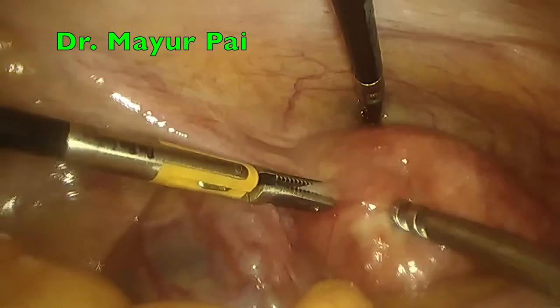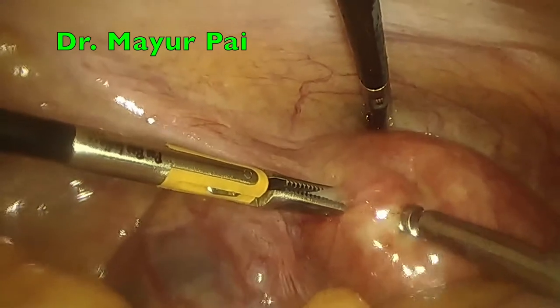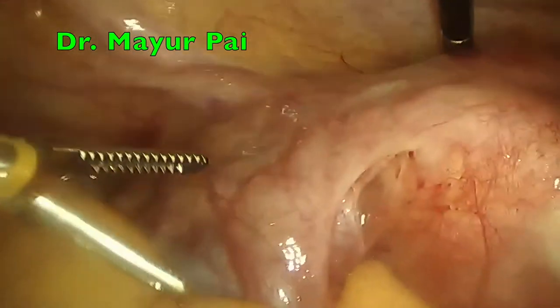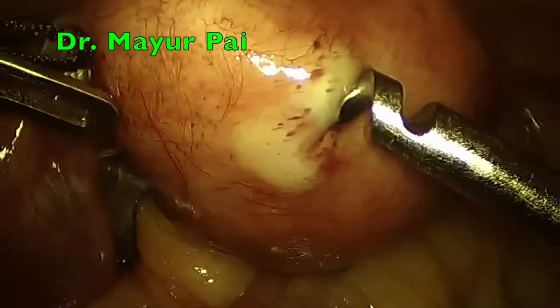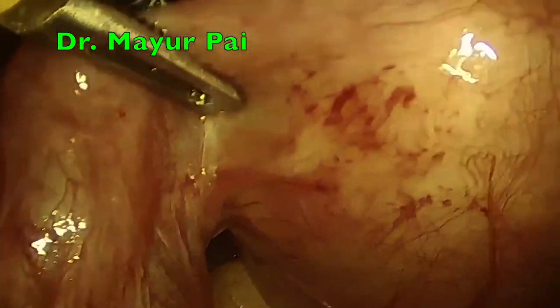Today I am bringing a video to you on laparoscopic hysterectomy. It's a straightforward case which has a left-sided tubo-ovarian mass with a hydrosalpinx. Let's see how we proceed with today's case.